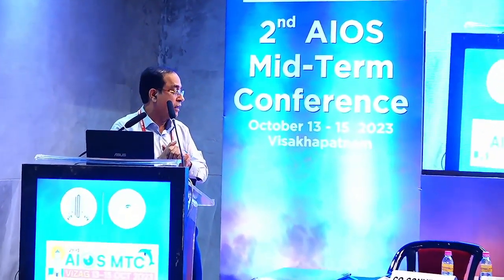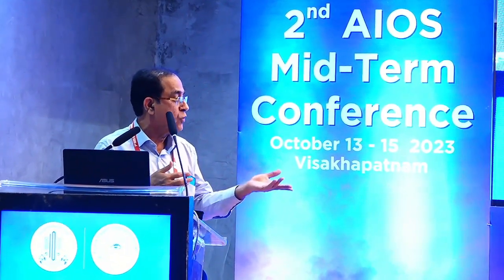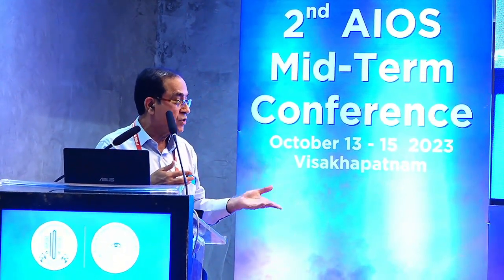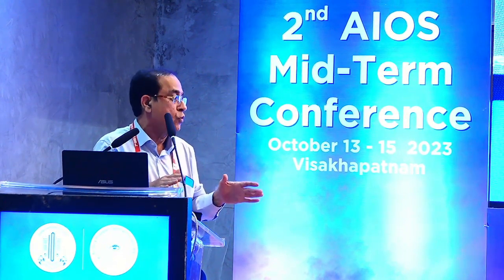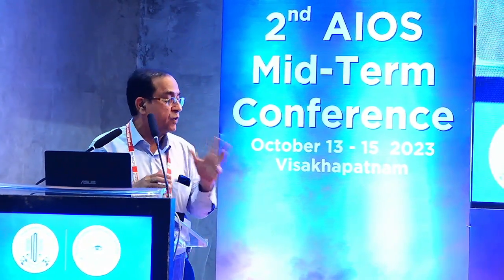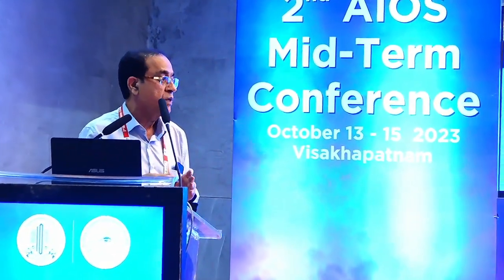If you do the explant, next time you may not be able to place the lens correctly into the bag if it is a little older, say 1 month or so, there may be some fibrosis and you may not be able to get exact access. So I rather prefer to do LASIK in these patients than going in again. And some of the astigmatism may not be because of the cornea, because over here you are doing a refraction-based correction. So maybe there is a lens tilt, or a retina tilt, or whatever may be the reason. So once you do a LASIK procedure, you are sure what you are going to do. So in such cases where the spherical equivalent is more, I do the LASIK procedure after 3 months. And if the spherical equivalent is nearly 0, I'll go for implant rotation.